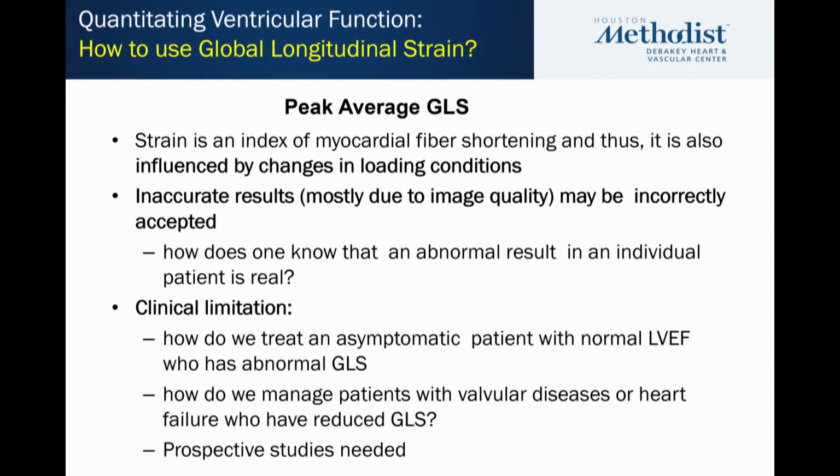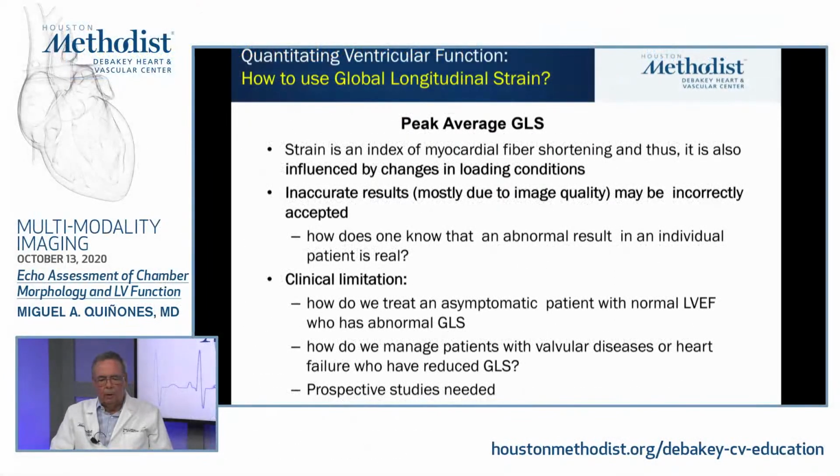How to use global longitudinal strain? Well, it is an index of myocardial fiber shortening, and thus is also influenced by loading conditions. Always keep that in mind.